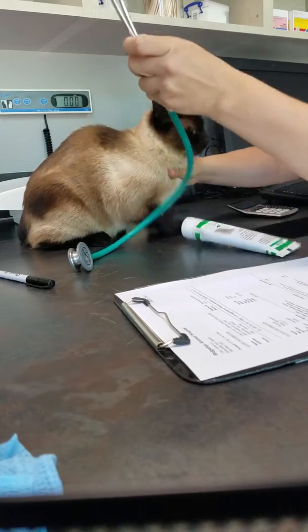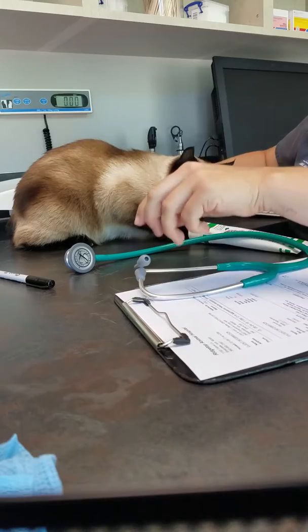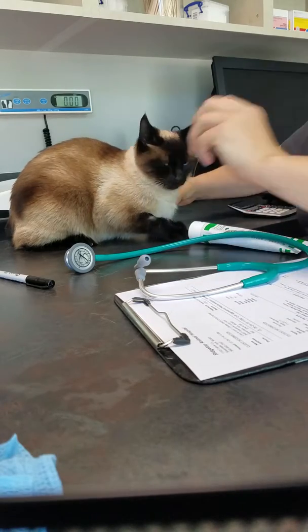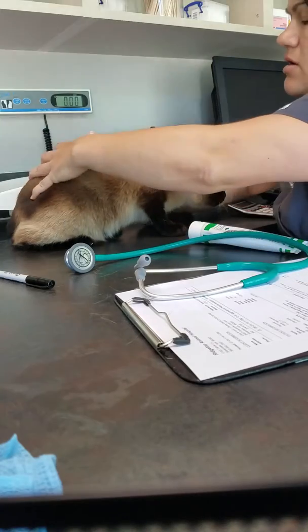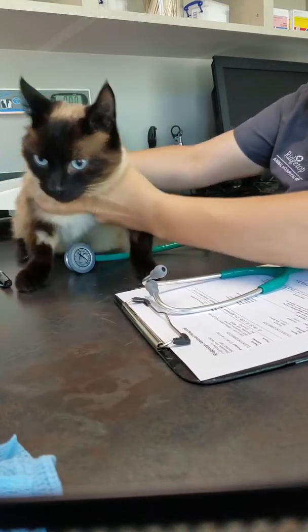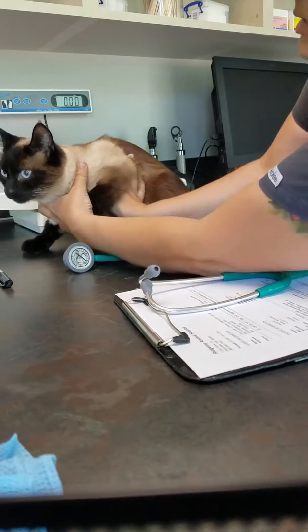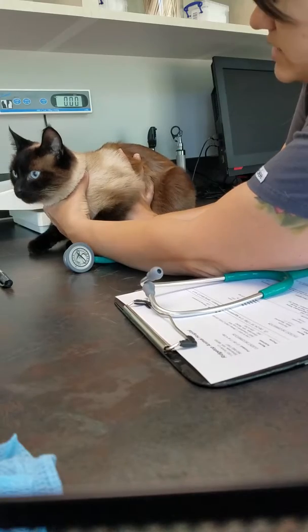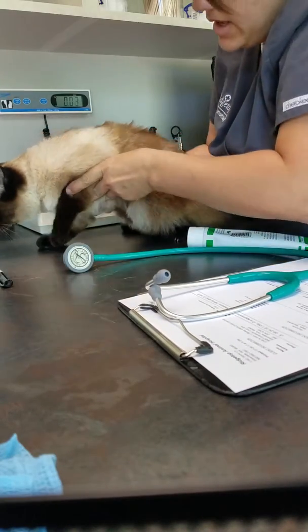So like I said, we can listen to the heart. And there's 4 PMIs, points of maximum intensity. And I was taught a little trick that on the left side of the patient, you can put your hand like this. It's harder on cats because they're a little bit smaller. But there's 3 points of maximum intensity on a cat.